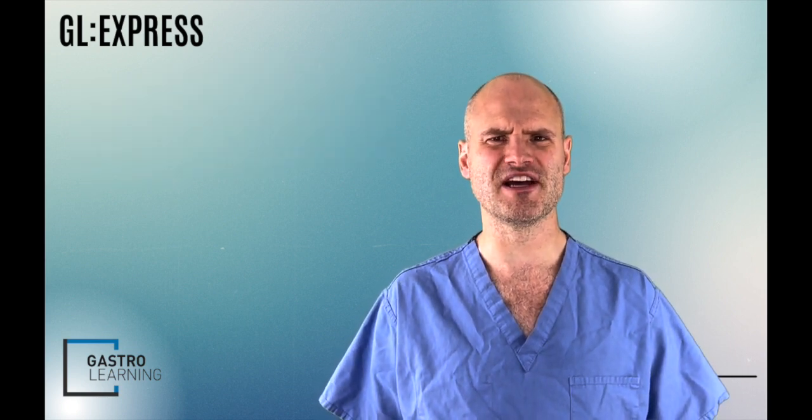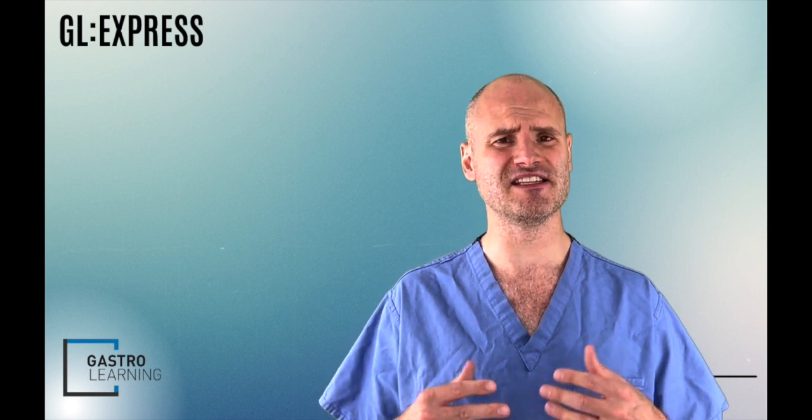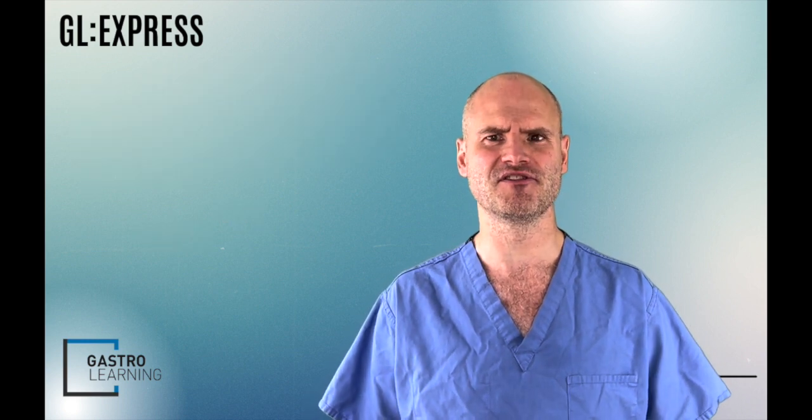These guidelines also suggest that endoscopic activity score is used in patients to assess disease activity in those with ulcerative colitis. They acknowledge in these guidelines that there are a large number of endoscopic scores, and they suggest that the Mayo endoscopic score and the ulcerative colitis endoscopic index of severity scores are those that are most commonly used, and therefore suggest that they should be used in your practice.